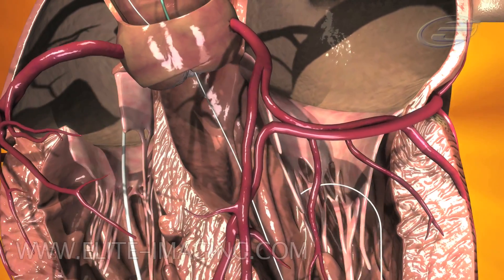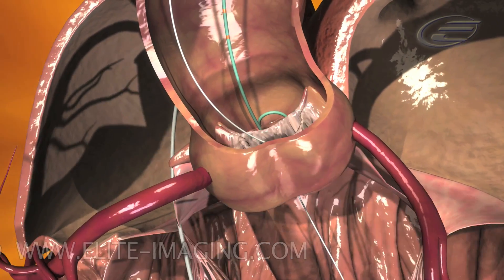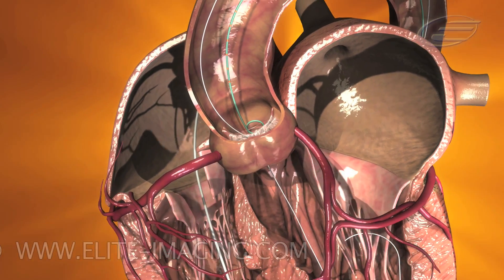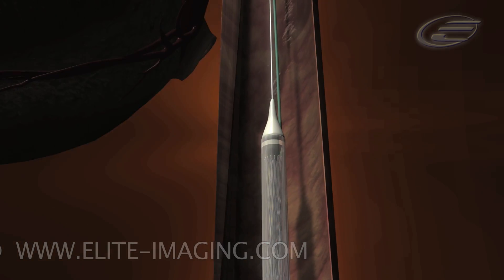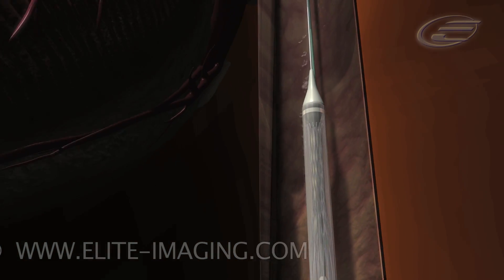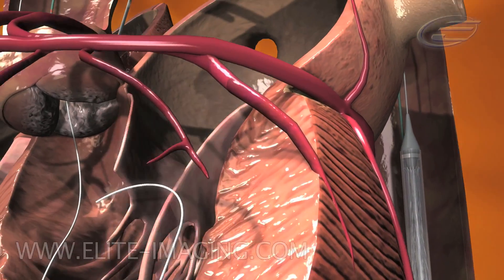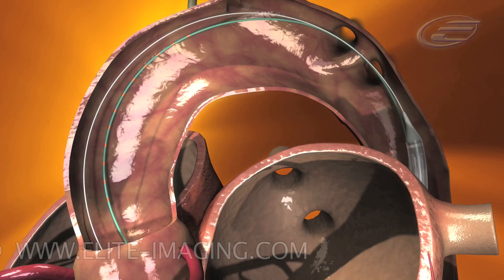Confirm that the graduated pigtail catheter is positioned properly in the non-coronary cusp of the aortic root. Confirm that the camera is positioned in the ideal annular viewing plane as predetermined earlier in the procedure. Insert the Medtronic CoreValve system into the 18 French introducer and advance to the descending aorta while maintaining strict fluoroscopic surveillance of the extra stiff guide wire.